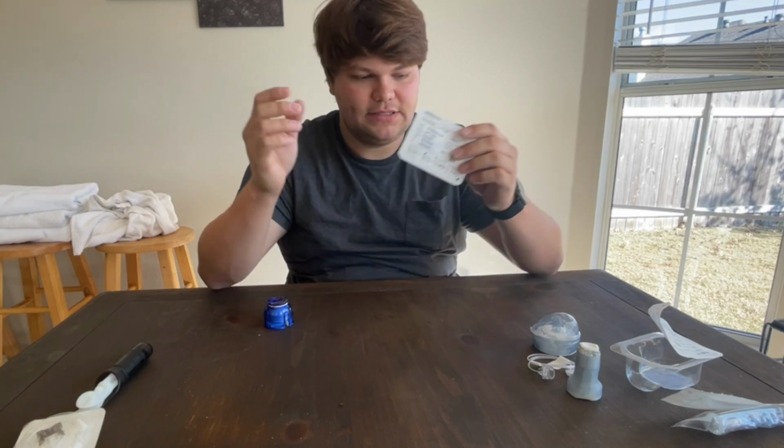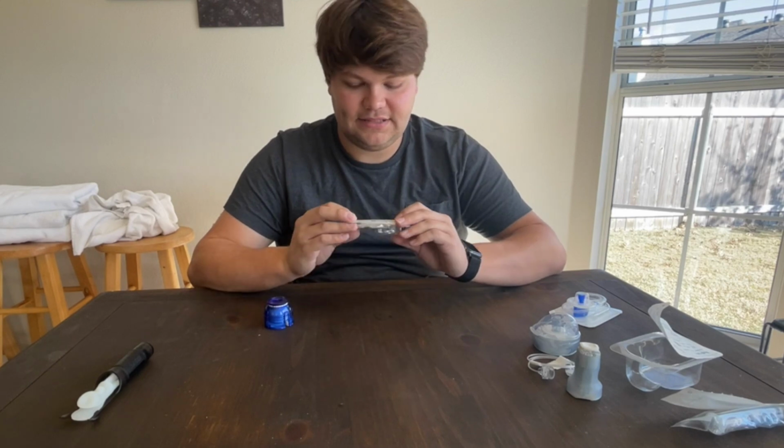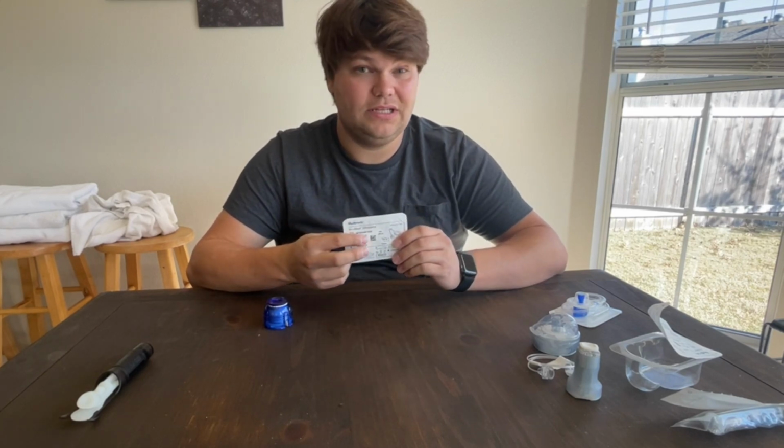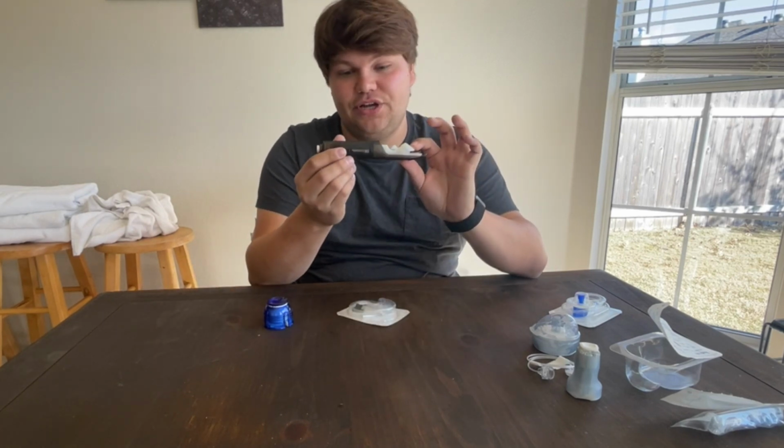I do enjoy these. And then the latest thing that I'm trying is the Medtronic, I think they're called Silhouette, whatever. You do have to buy an inserter for these.